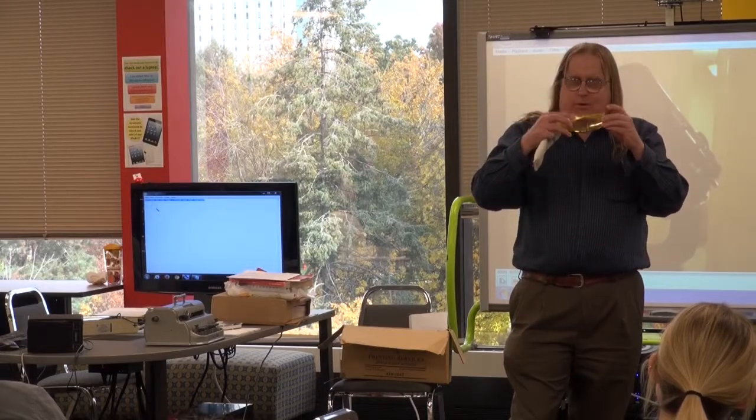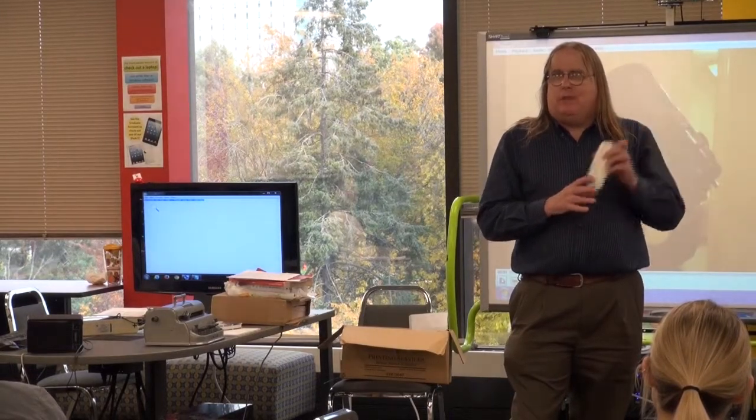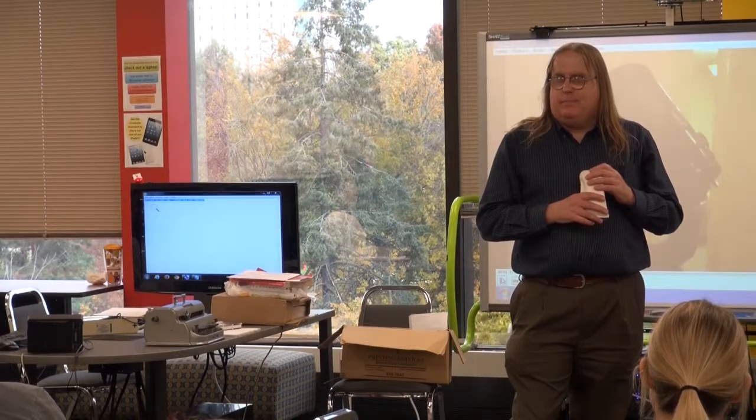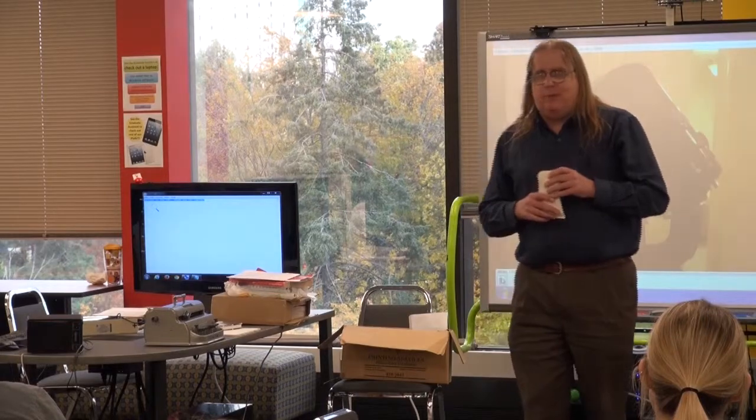The human eye is very sensitive, I think, to the greenish yellow area of the spectrum. So that's why the glasses are the color that they are. Old school again. Hey, the way I look at it, I'm very pragmatic. If it works, I use it.